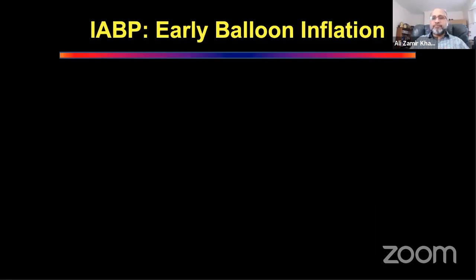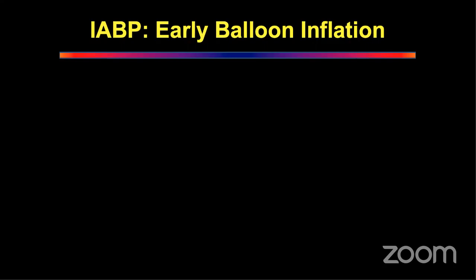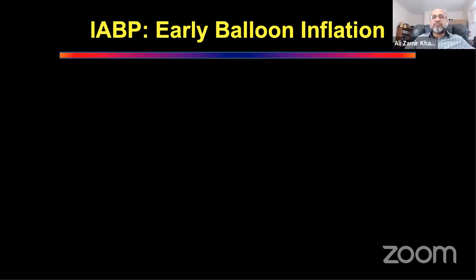Okay, all right. Show me what's going to happen in an early inflation of a balloon pump. What happens if your balloon is not triggered properly and it is causing early inflation of the balloon? Which means that the balloon is inflating in systole, late systole. Is that okay or is that a problem? That is counterproductive. Just quickly draw me a diagram of what happens if the balloon is triggering early. So, early inflation of balloon pump.